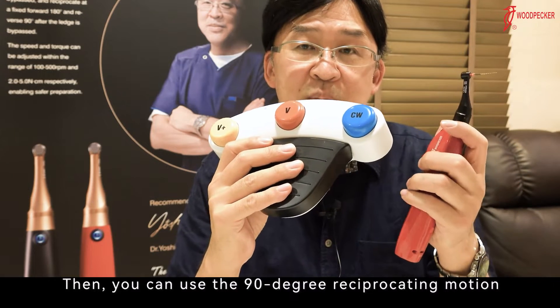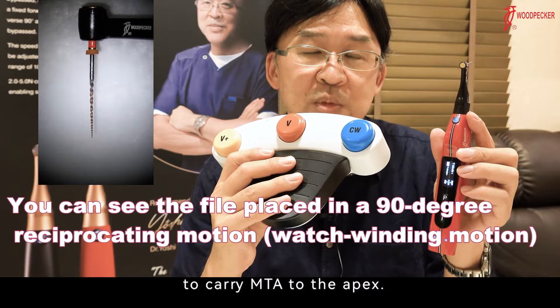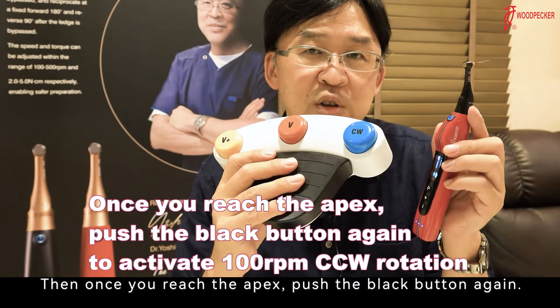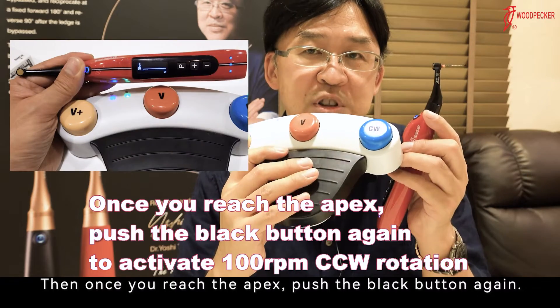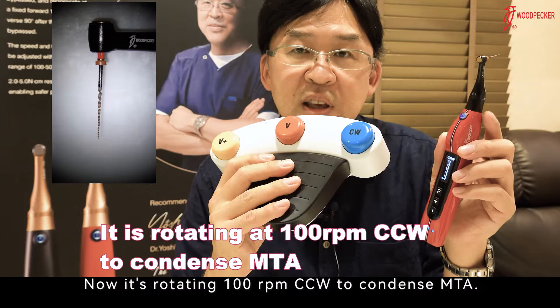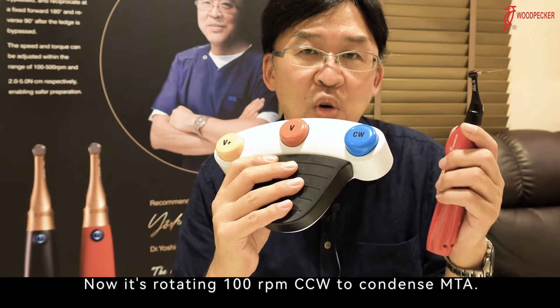You can use the 90-degree reciprocating motion to carry MTA to the apex. Then, once you reach the apex, push the black button again. Now it's rotating at 100 RPM counterclockwise to condense MTA.